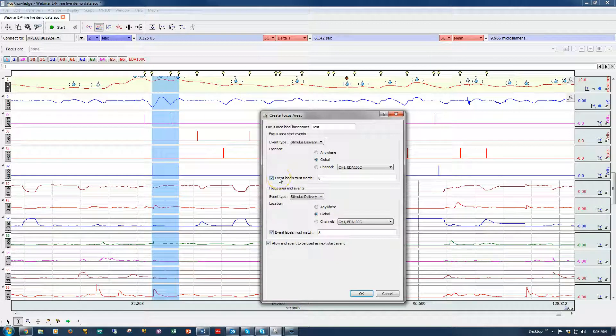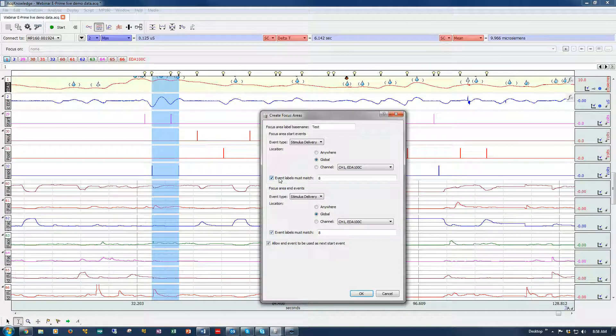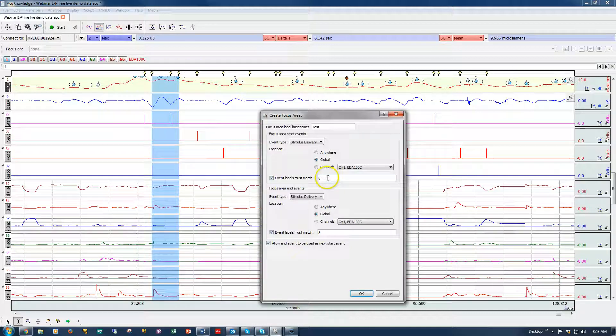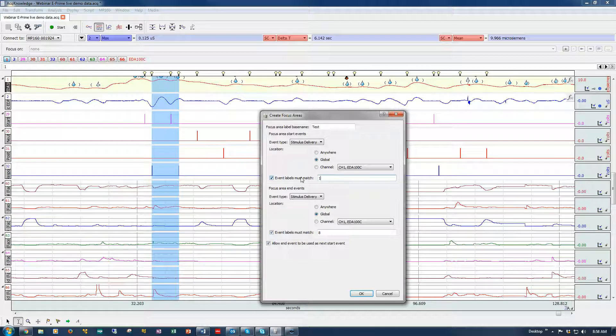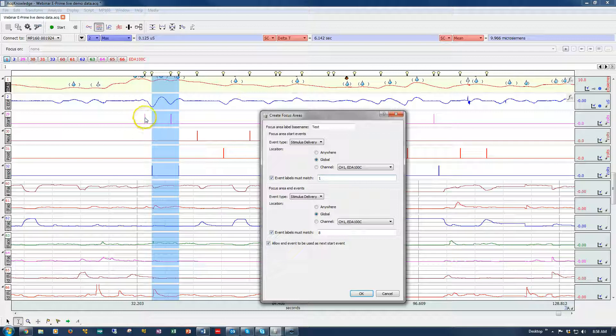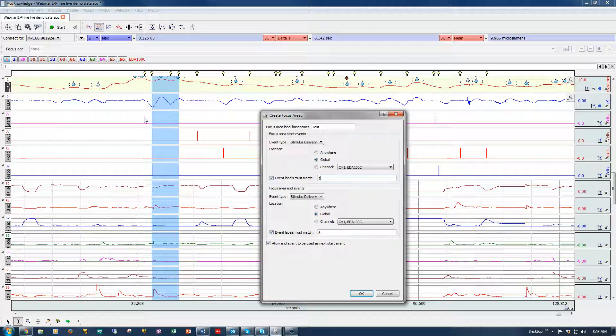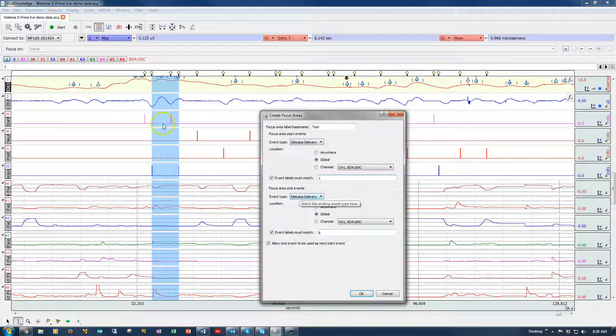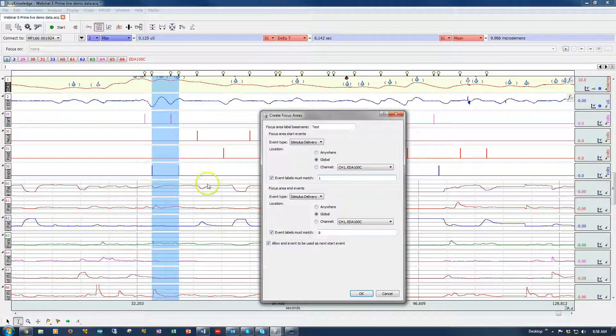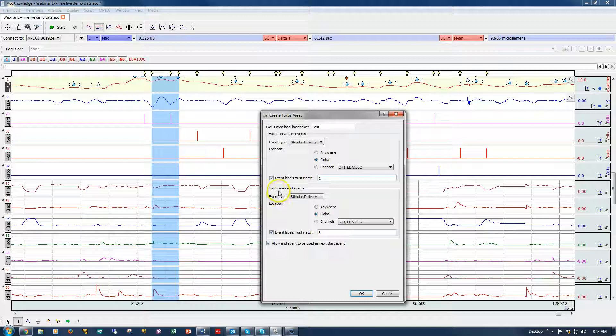I'm going to look for these types of events and I'm going to create a label. I'm going to say I want to go between Event Type 1, which corresponds to this channel here, this pink channel, which is when a startling image was presented to a participant. And then I'm going to create the focus area between that and the participant's response, just as an example.